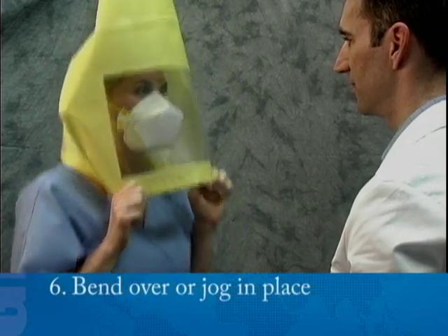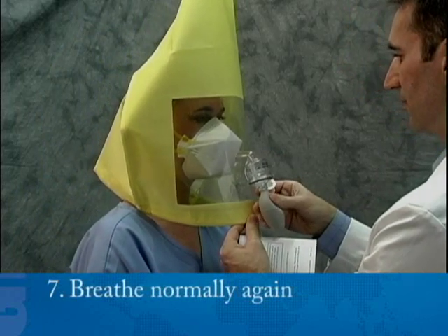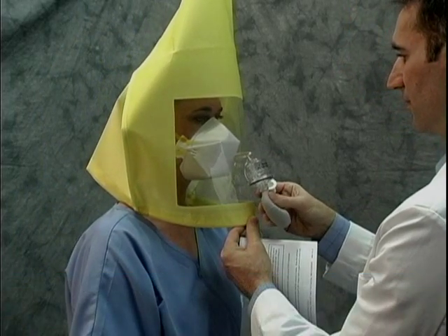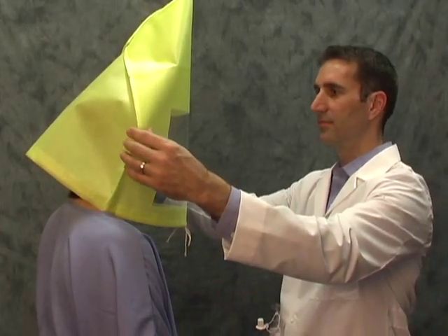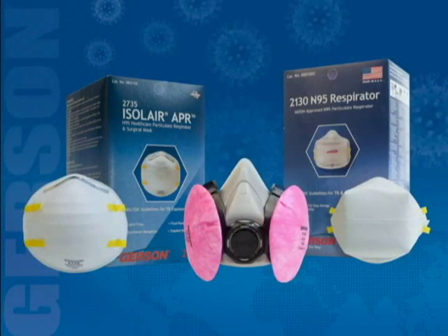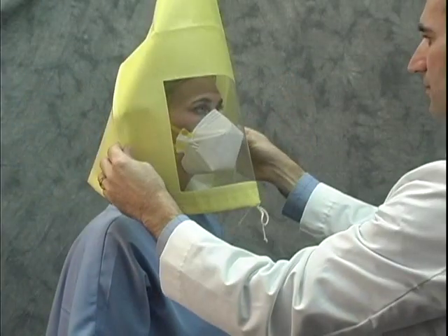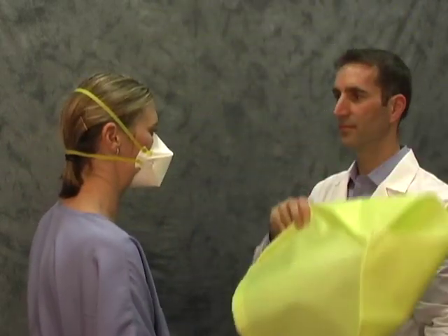Number six, bend over at the waist as if touching your toes — be sure to hold on to the hood when bending over. You may substitute jogging in place for this exercise. Number seven, breathe normally again. When you complete the exercises without tasting the test agent, the respirator fits you properly. If at any time during the fit test you can detect the same taste you did during the sensitivity check, inform the instructor immediately — it means your respirator does not fit properly. You must then refit your existing respirator or select a different size or style. Once you clear the taste from your mouth, you'll repeat the fit test procedure.